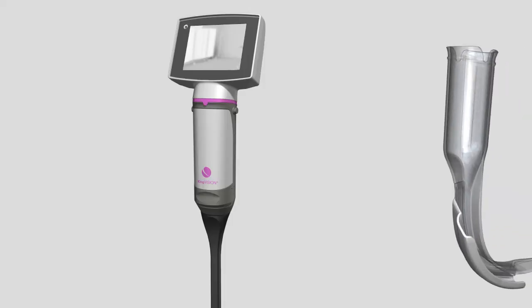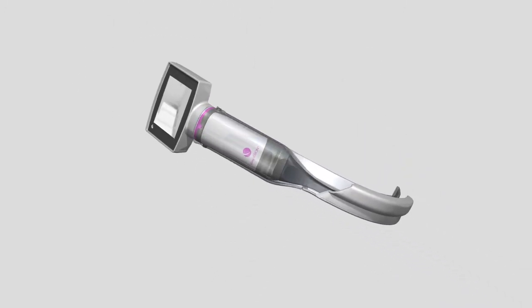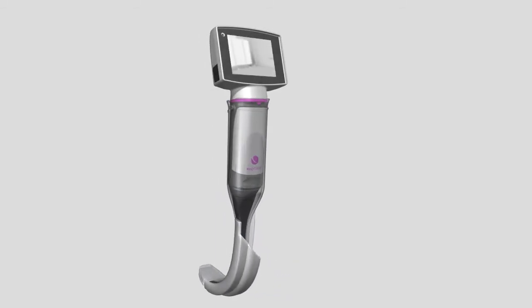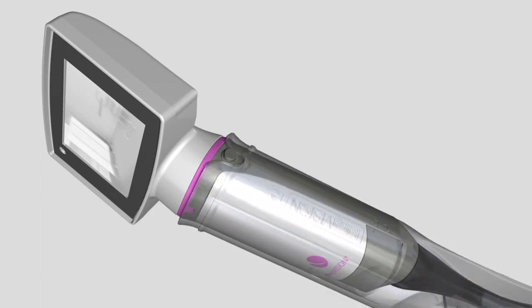Attach the selected A-Blade by aligning it so that the curved section of the blade faces the back of the display. The blade and the adapter will only fit together in one orientation. Slide the blade over the video adapter until the neck of the adapter and the neck of the blade meet. Push firmly until the blade is fully engaged into the adapter.